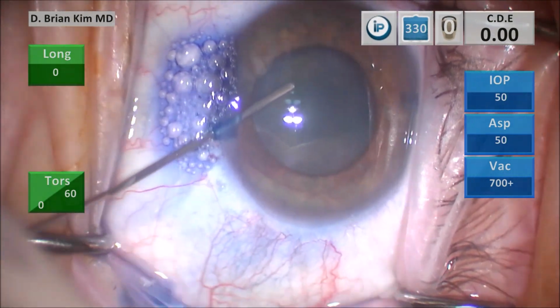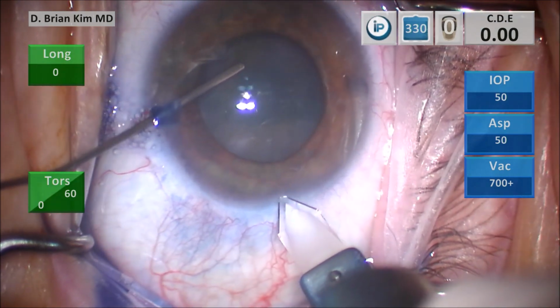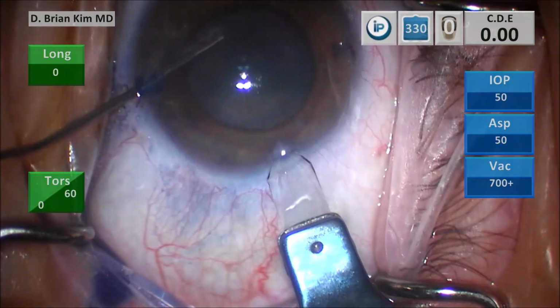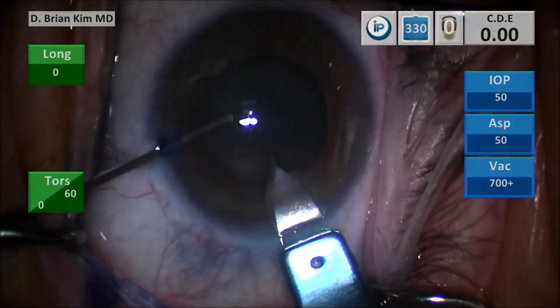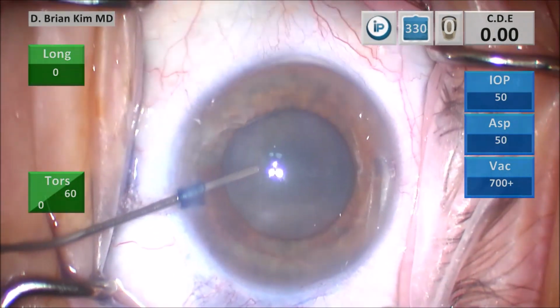So go ahead and inject some dispersive viscoelastic to fill the anterior chamber. And this is a triplanar corneal incision. I make a vertical groove, place the blade into the deep part of the groove, tunnel, and then enter. I'm pushing some more viscoelastic to fill the chamber even more here.